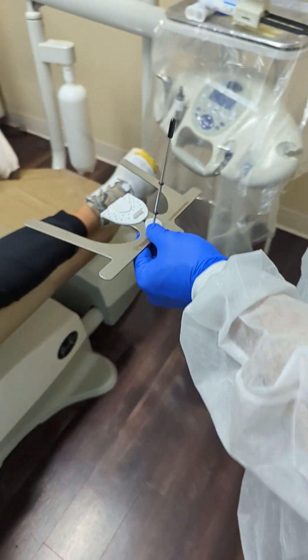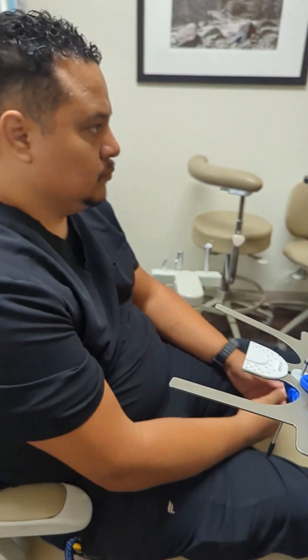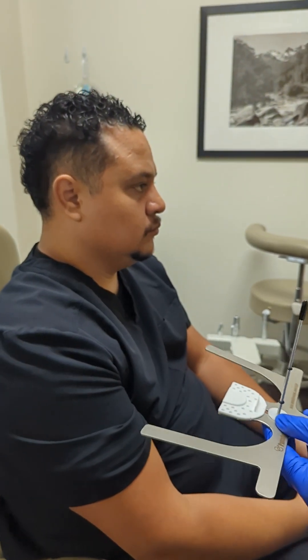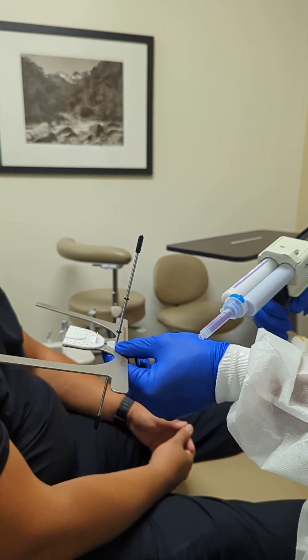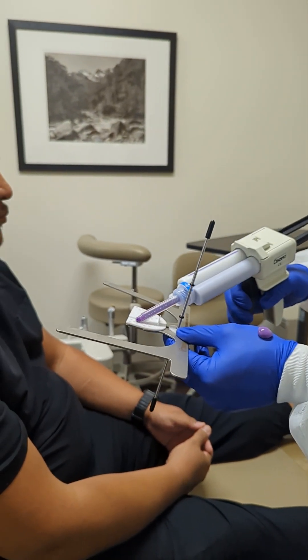We can look at our patient here, have him sit upright, and then we're going to use our bite registration. This is a 45-second working time, a minute and a half set time.